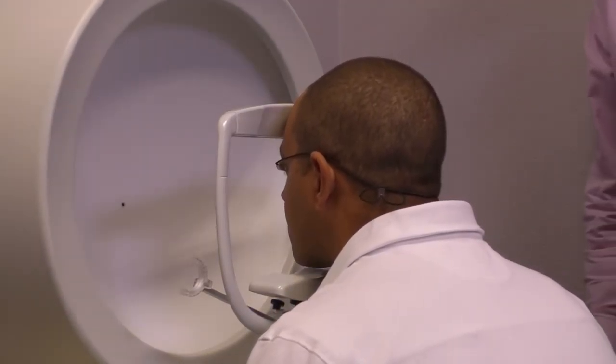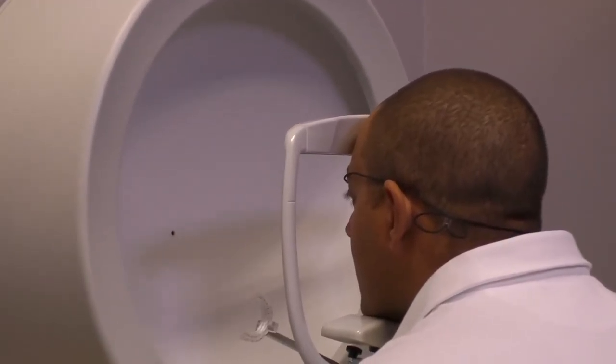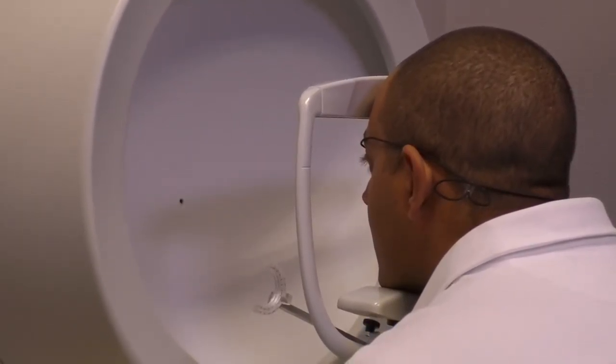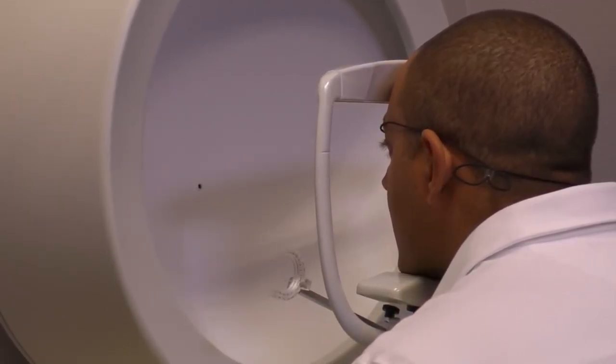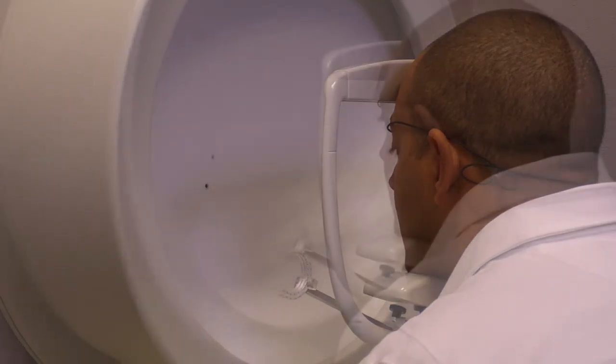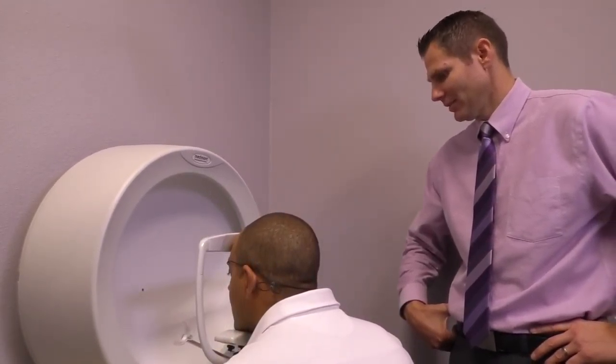Get your forehead back in there. Looking straight ahead at that fixation point again, that target. Start clicking whenever you see those lights, just like that. Good job — key thing is keep looking straight ahead. All right, good to go.